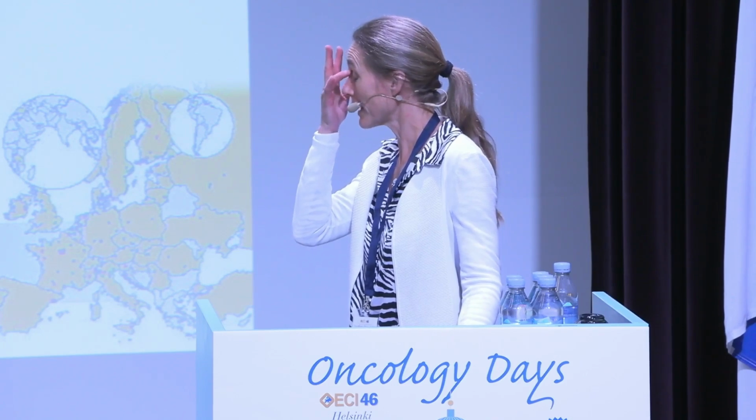For prostate cancer, we now have time slots of 30 minutes, and most of the time we finish within 25 minutes. I think it is experience, and my colleague always said, don't pixel peep, try to be fast. And then we rarely see the problem of the filling bladder. Maybe that is because we always ask patients to come and empty their bladder and then drink 2 glasses of water and then start the treatment.